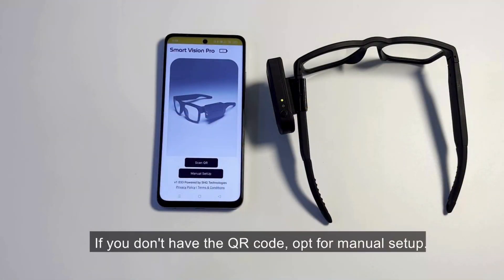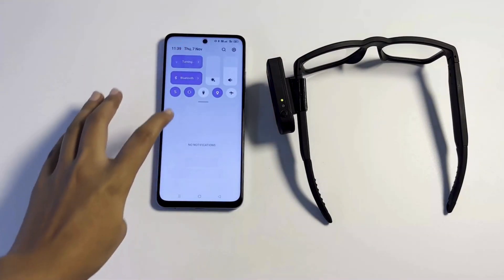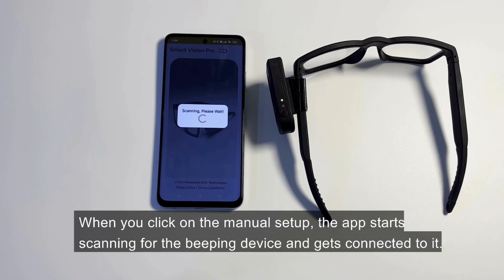If you don't have the QR code, opt for Manual Setup. When you click on the manual setup, the app starts scanning for the beeping device and gets connected to it.